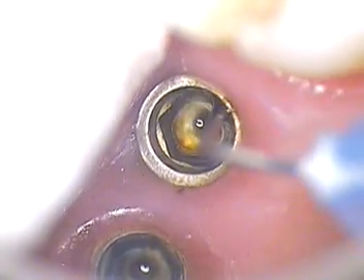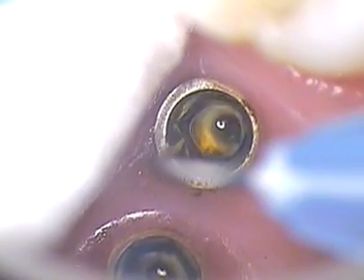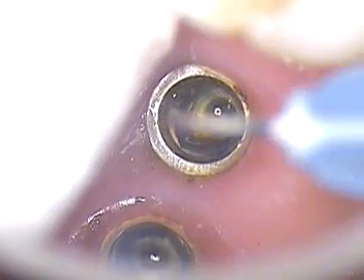Look at how much is coming off of this lip here. That's amazing. This is all inside the lip. This lip is clean now — the other one was filled with stuff.